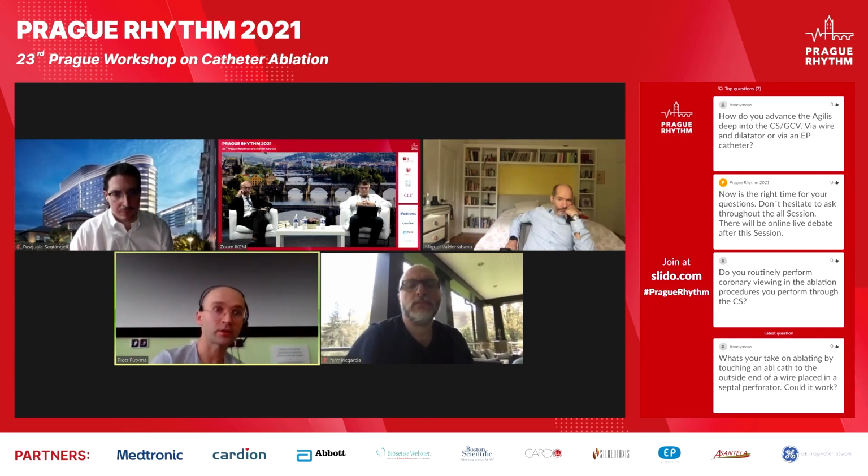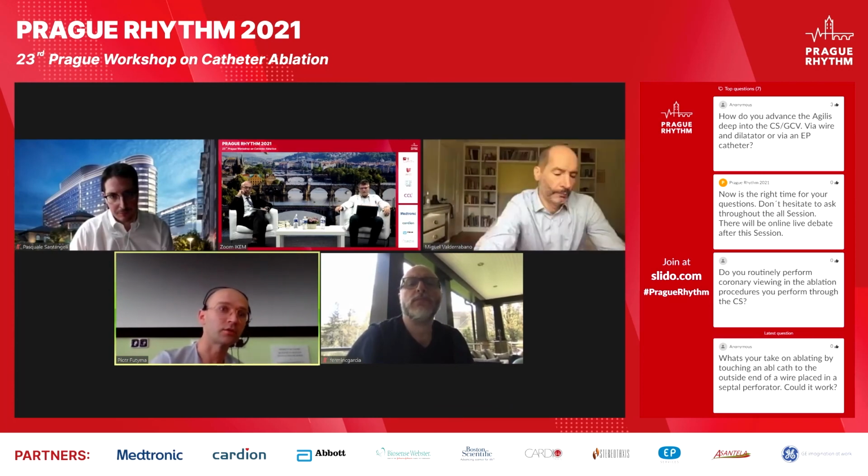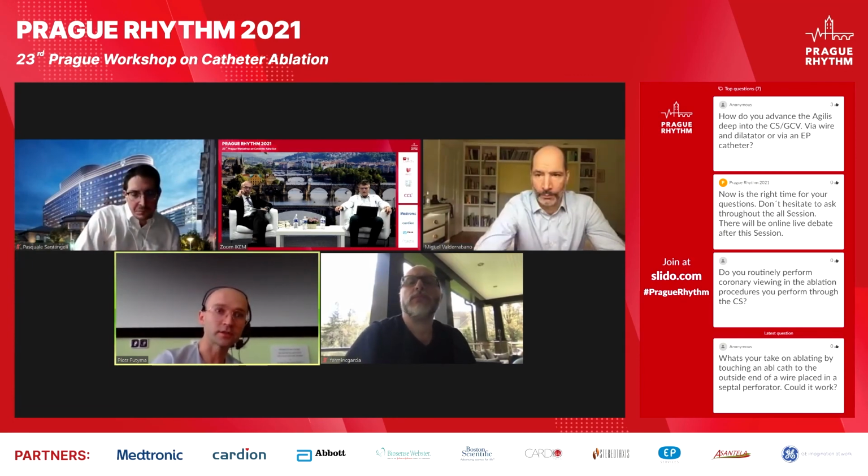I do not have personal experience with that in a clinical setting, but I think that large tip electrodes, 8mm tip catheters, can be a particularly, let's say, promising option for these kinds of patients, if somebody decides to perform bipolar ablation in this setting.